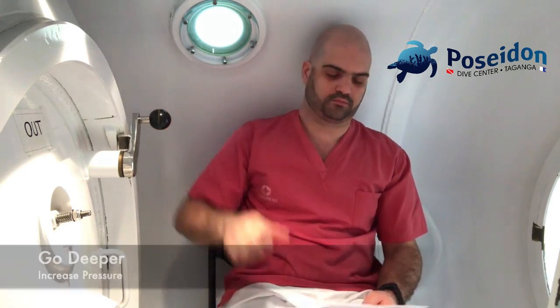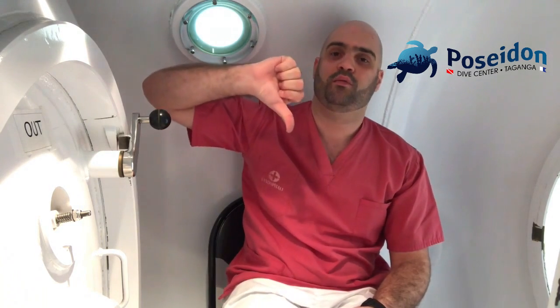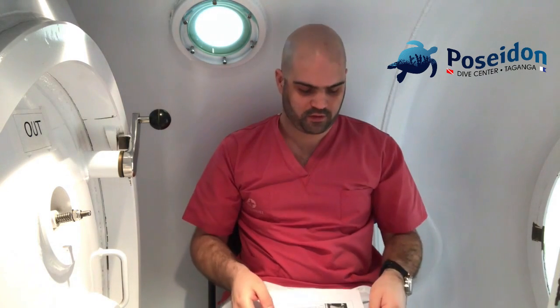Then we have another sign that is like this, and it means go deeper or increase the pressure. In this chamber in Iceland, we talk about depth, because all the gauges are in meters of salt water, and we talk about going deeper or going shallower. So this sign will mean to go deeper. This sign will mean go shallower, or go to the surface, or decrease the pressure. If you want to maintain the same depth, then you have to do this sign, okay? With your hand flat, you just do a movement like this, okay? This means stay at the same level or same depth.